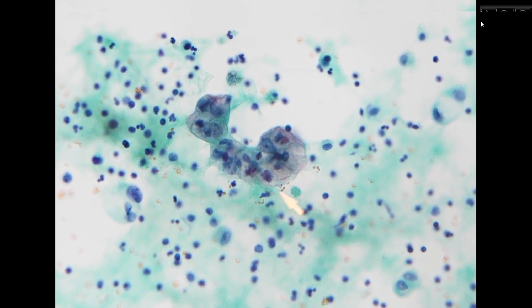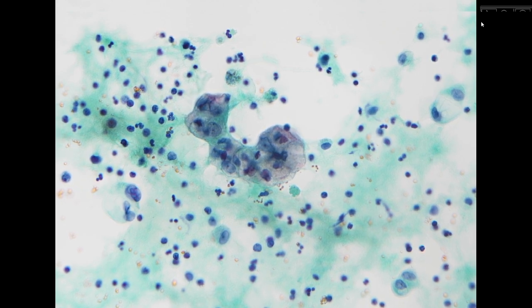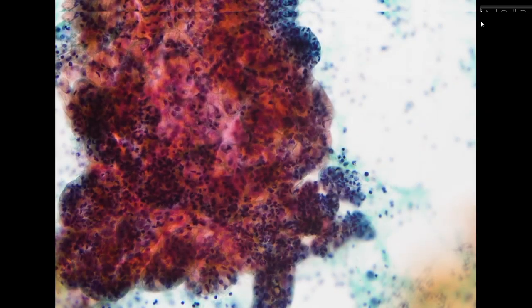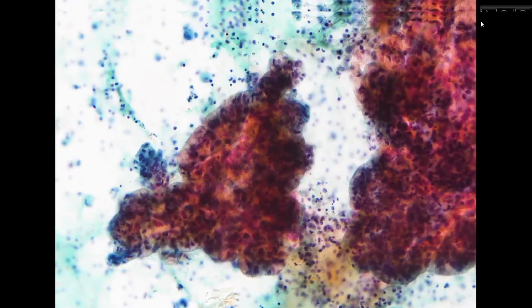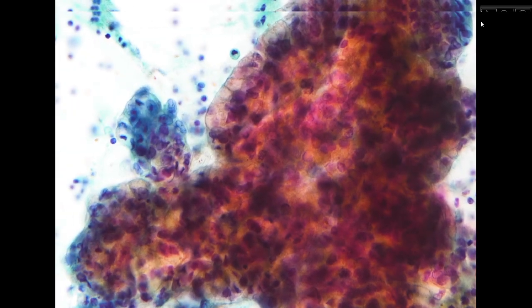Because it is a pleural effusion specimen, this is very unusual if we consider that the most common origin would be from the lung. This is very unusual for lung cancer. With this morphology, we will usually think about a pancreatobiliary primary adenocarcinoma with mucinous differentiation. These types of cells are very obvious in every cluster. This is a much larger cluster, and we can still appreciate very prominent mucinous differentiation of this metastatic adenocarcinoma.